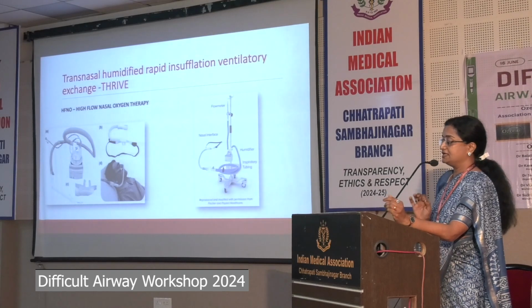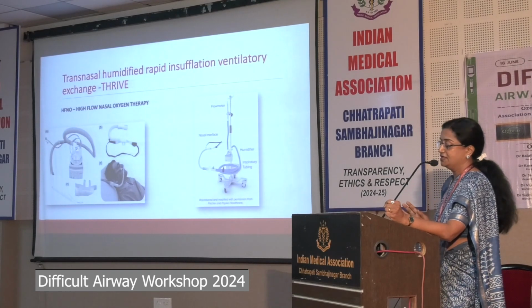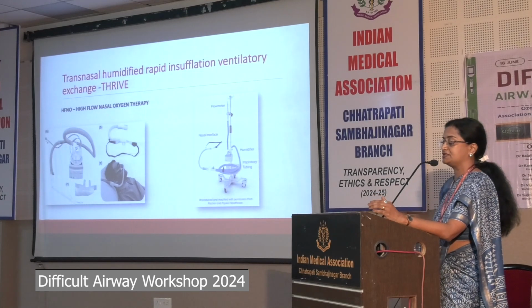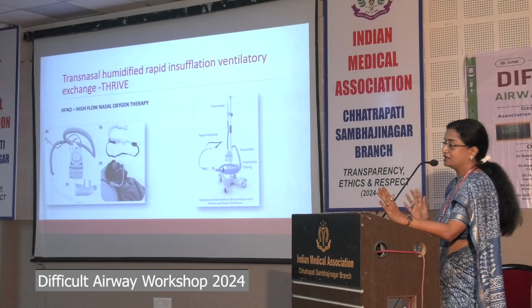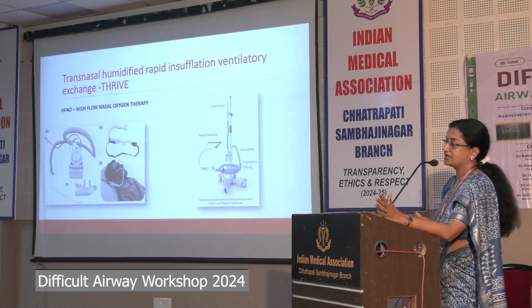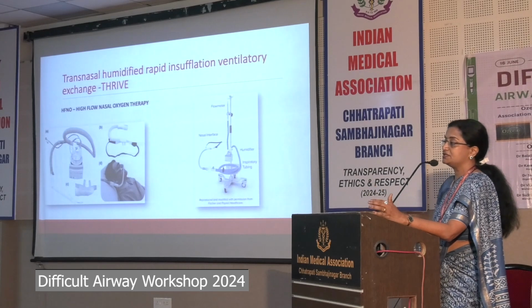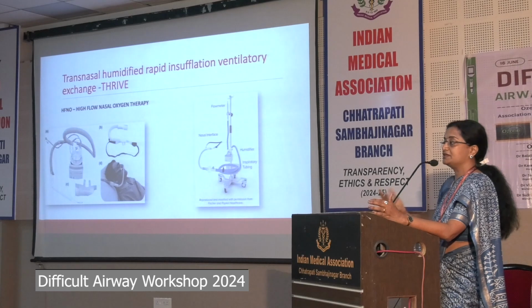The transnasal humidified rapid insufflation ventilatory exchange, that is THRIVE. This improves the delivery of oxygenation at variable concentrations. It reduces the work of breathing, provides CPAP, and assists in carbon dioxide removal too. This can be used in sleep apnea syndrome, when you're doing awake craniotomies. You can improve outcomes in your ICU patients with various comorbidities.